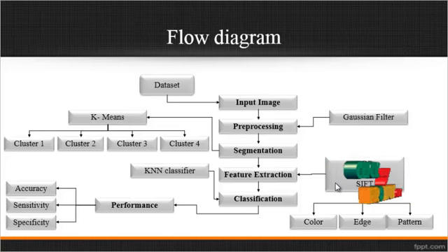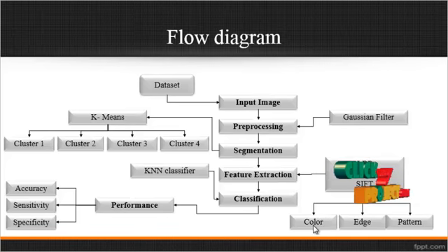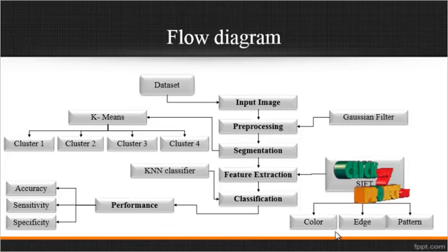For efficient feature extraction, we use the LBP, histogram and SIFT. LBP represents the patterns, SIFT represents the edges, and histograms represent the color features. By combining these 3, we can form the combined test features. Hence, this is more reliable and more sensitive.